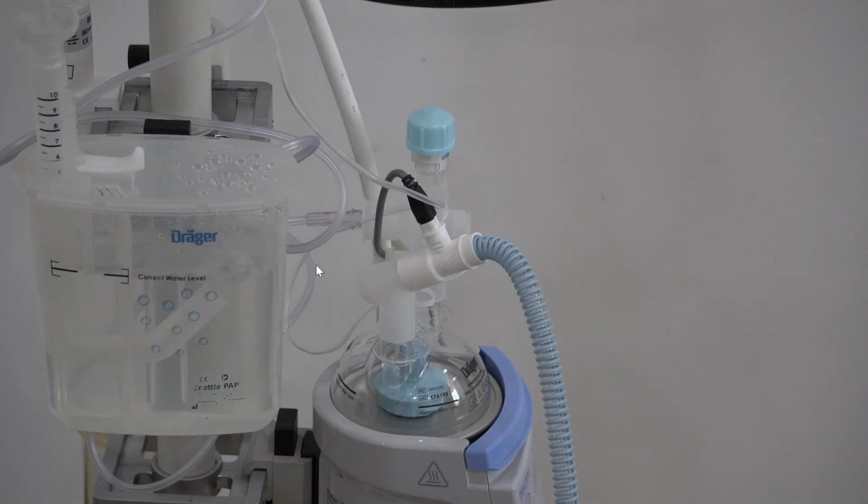So at the end of the day, the main target of the ventilation, and I think Linda has addressed it in a lot of detail in her lectures, is appropriate gas exchange. The way gas exchange happens is the oxygenated air from the ventilator or from the bubble CPAP system is delivered to the patient.